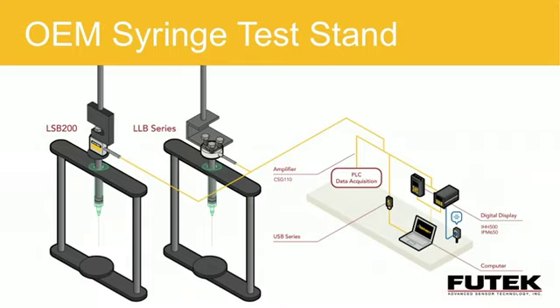Now, one side application I'd like to tie into this is the use of a non-magnetic load cell in this exact application for soft tissue imaging, specifically in MRI environments. The fluid needs to be dispensed at a very specific rate in order for the imaging process to occur correctly.